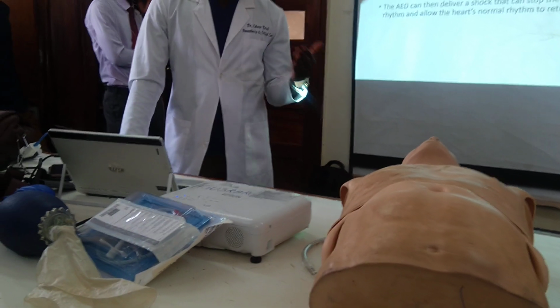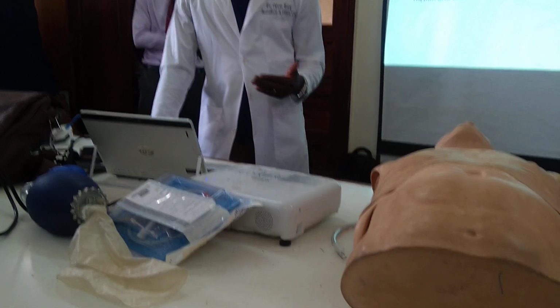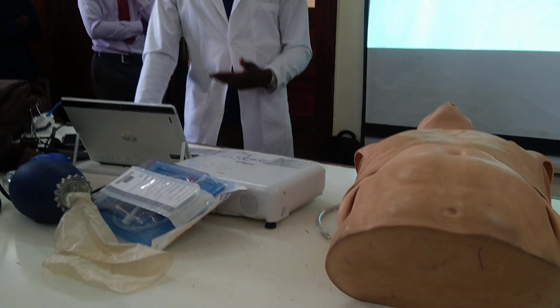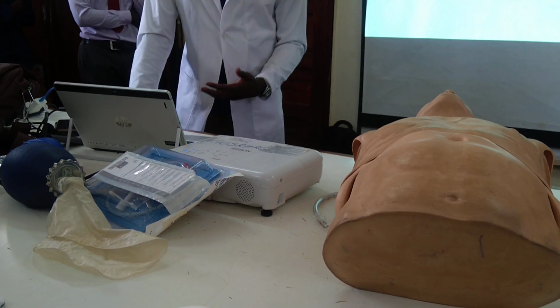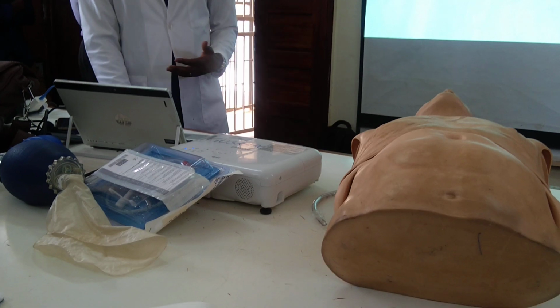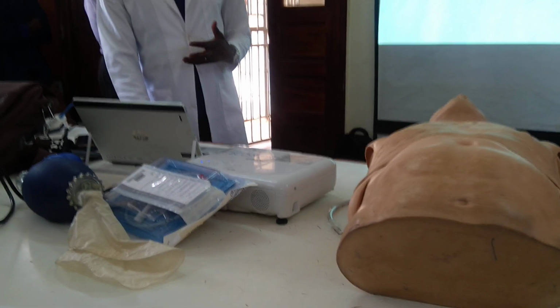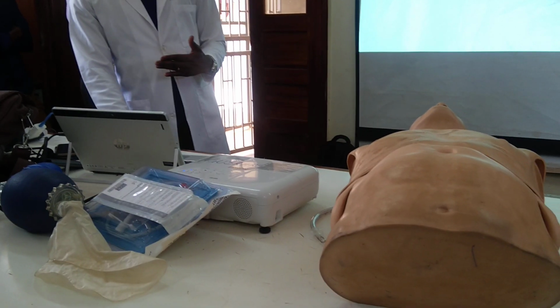And if it does not need a shock, it will also tell you no shock advised. Proceed with chest compression. If shock is advised, then you prepare for the shocking. Now the AED can deliver a shock that can stop the abnormal rhythm of the heart momentarily to allow the heart's normal rhythm to return.